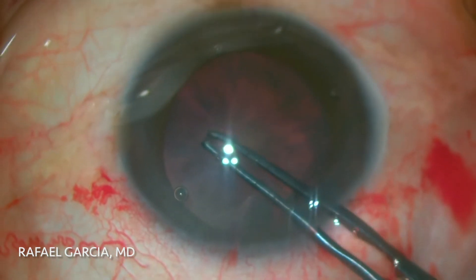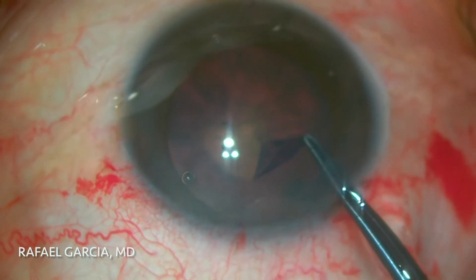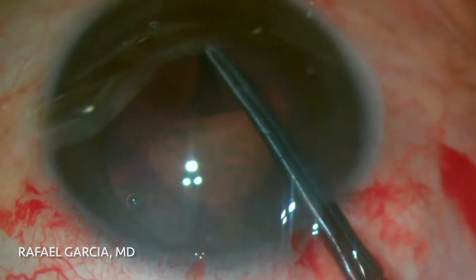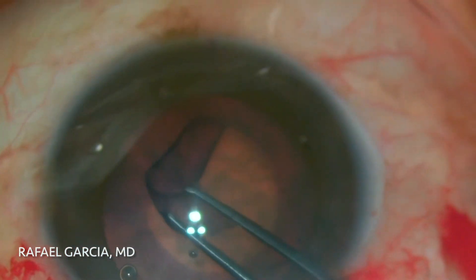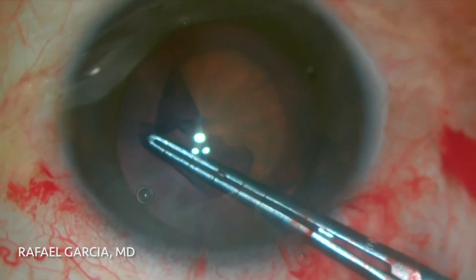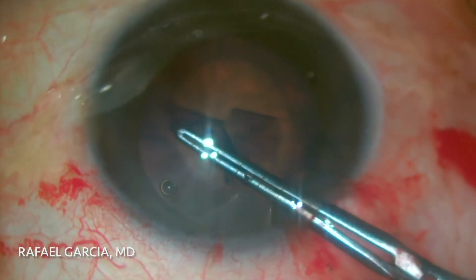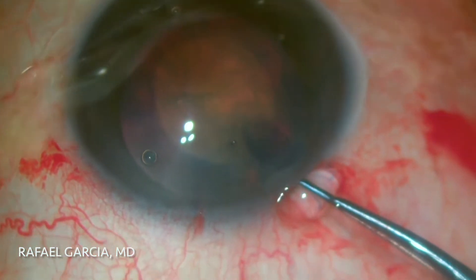Here we're performing a routine phaco under topical anesthesia. Some trypan blue dye is used to stain the capsule, as it is a somewhat dense cataract — we all know how important it is to make a nice capsulorrhexis in such cases. This will ensure good centration and stability for the IOL in the long run. We're taking our time to do a perfect, round rexis using a Utrata forceps with arcs on its shafts to guide us to the desired size.